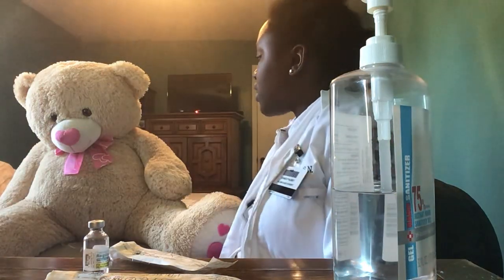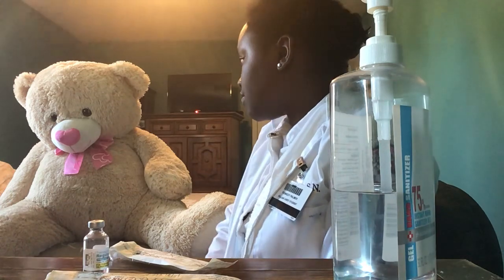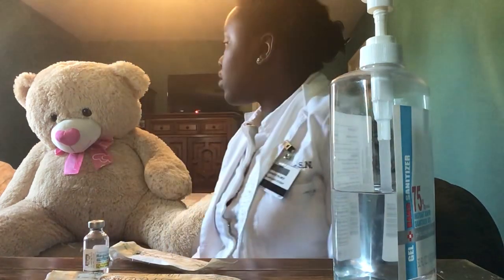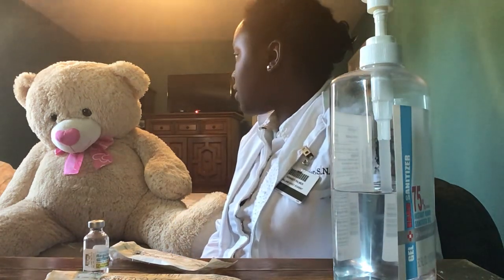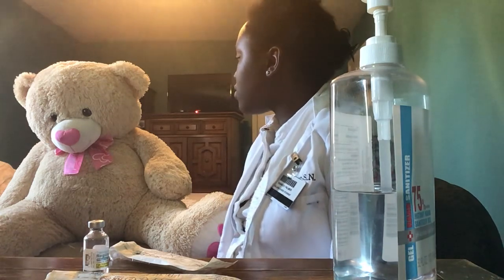Hello, my name is Kennedy, and today I'll be administering your IM medication of Haldol. Okay, I'm just going to verify the physician's orders. Okay, and can you verify your name and date of birth for me? Okay, and I'm just going to perform a focused assessment on you.